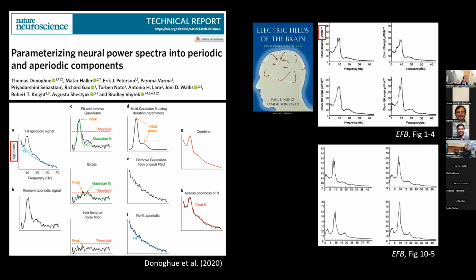probably you are using the data recorded in the hospital. Sometimes it's from the hospital, but many times, because I'm a psychologist, my data sets were from the cognitive experiment labs, like psychology labs. And you don't watch those data collections very closely. That's why you miss the body movement, and apparently those body movements contribute to the lower frequencies, which is probably why you see a nice 1/f curve.